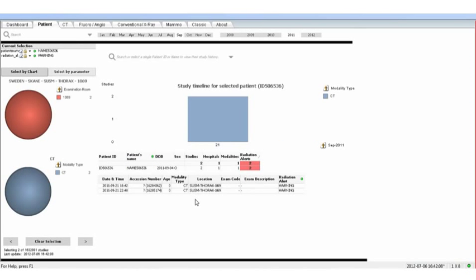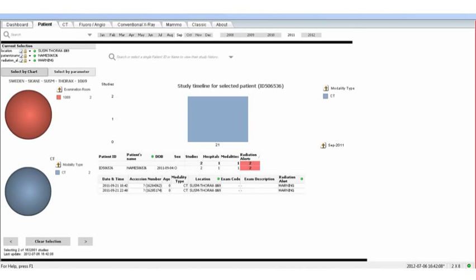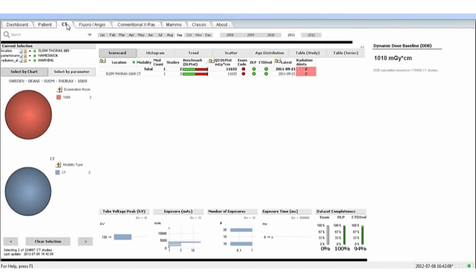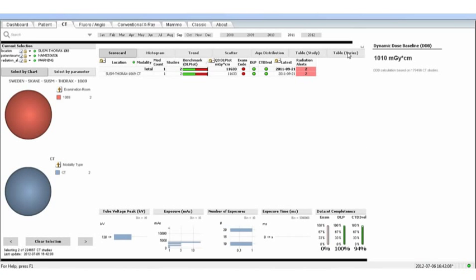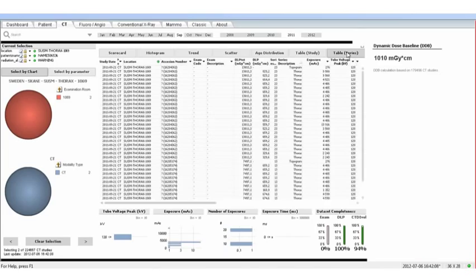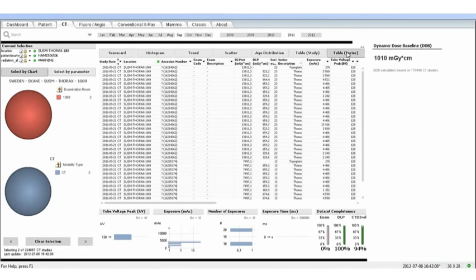This then takes you directly into the dose information. To go into the detail of the dose delivered to the patient, click on the CT tab and then you are directly into the individual dose record for this patient.